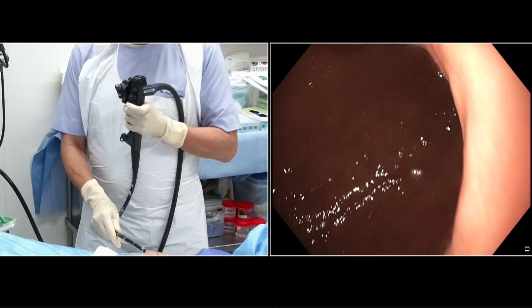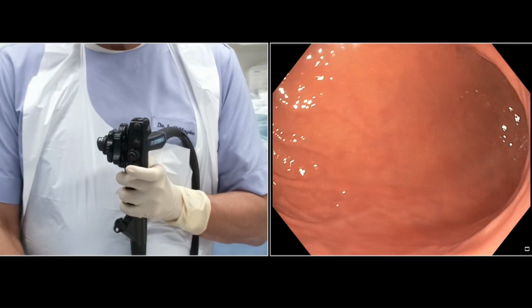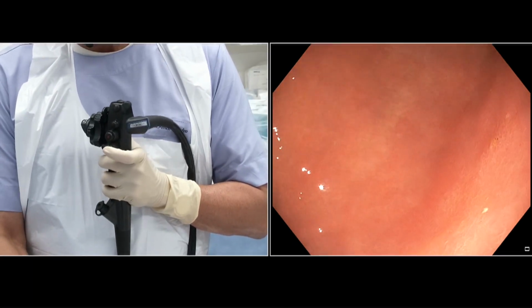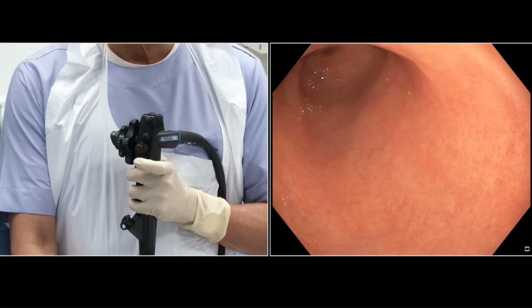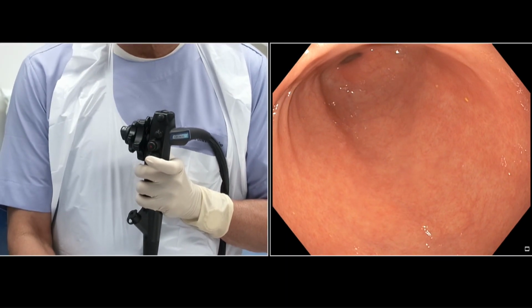body of the stomach. So now that I am inside the stomach and I have already seen the fundus of the stomach, now in the stomach we have to carefully inspect each and every square centimeter of the mucosa. You see now what I am going to do is carefully inspect the antrum first, make sure that the mucosa is not pale, the pink color is still continuing right till the pylorus.